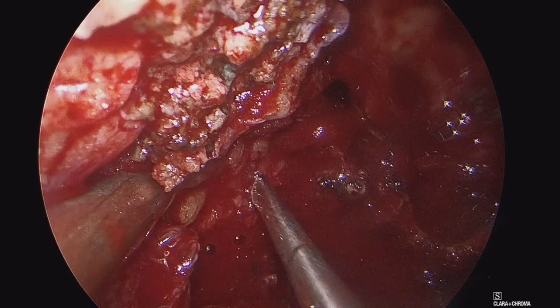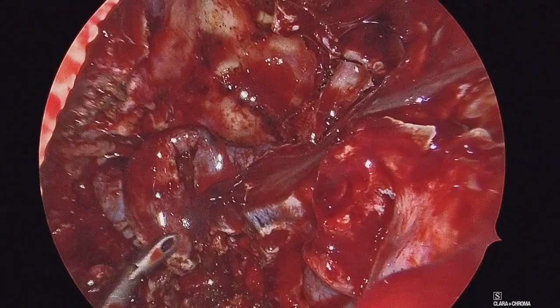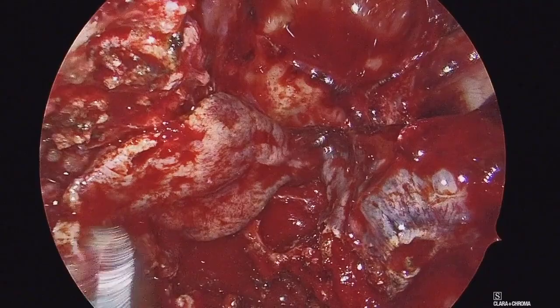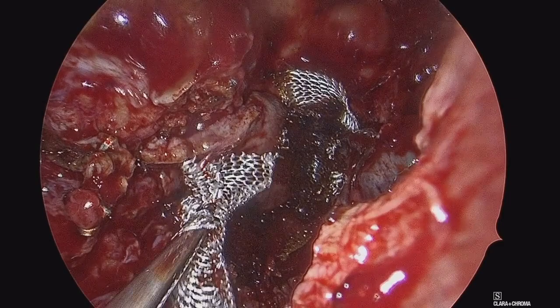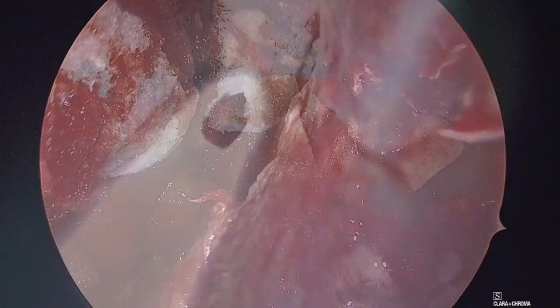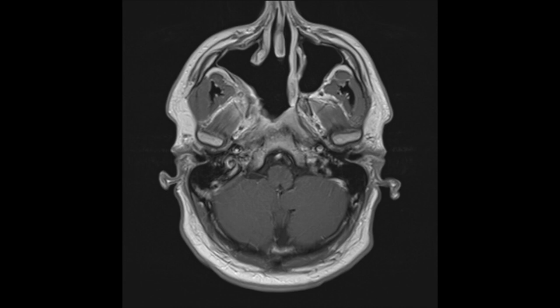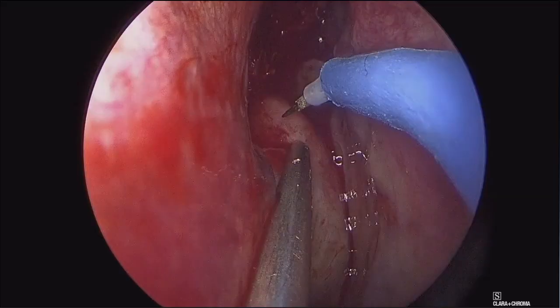There is no CSF leak in this particular case, but to cover the exposed dura and area along the middle cranial fossa, we'll take our left-sided nasal septal flap and bring it across midline to cover the area where we placed the fat graft right along the middle cranial fossa. Once that has been completed, we'll place some packing material — here is oxidized cellulose being placed along the flap followed by gel foam — as well as resorbable longer-lasting nasal packing and Doyle splints. Here is an image of a three-month postoperative MRI scan demonstrating the surgical resection, evolving postoperative changes, and no evidence of residual tumor.